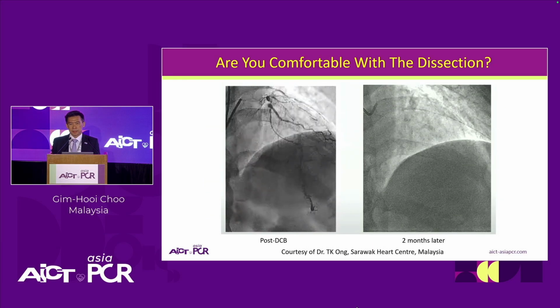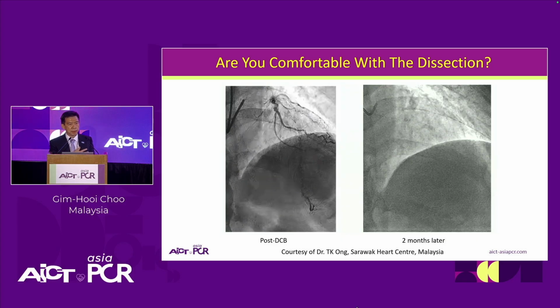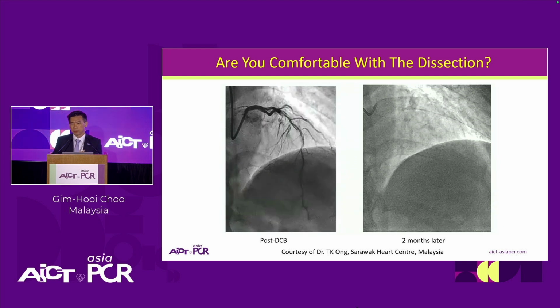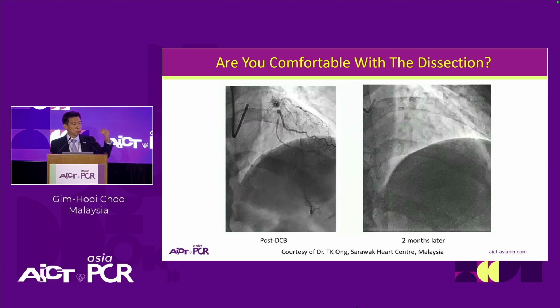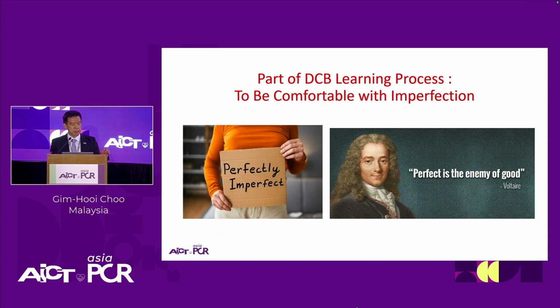Are you comfortable with this? This is my colleague who did the LAD preparation, a lot of type B dissections, long, large residual stenosis. I'm not telling you to accept this. I'm not comfortable with this. But in experienced hands, they may be comfortable, and look what happens 2 months later. But you have to look at your confidence level. If you're not comfortable, put in a stent. It's okay. It's part of the strategy.